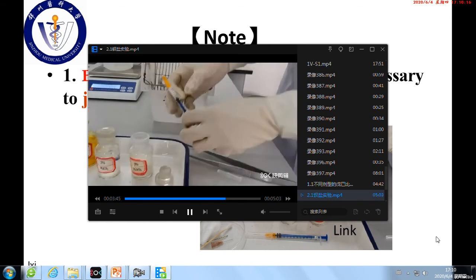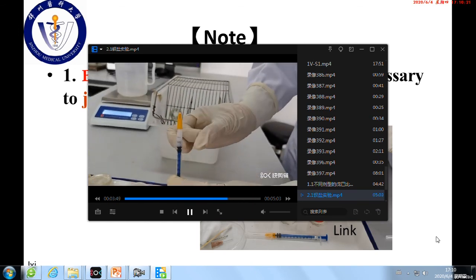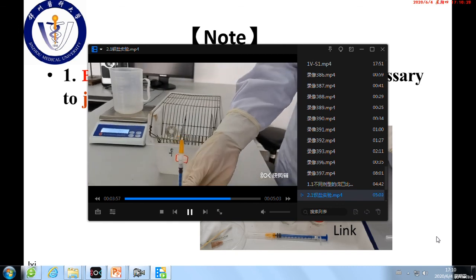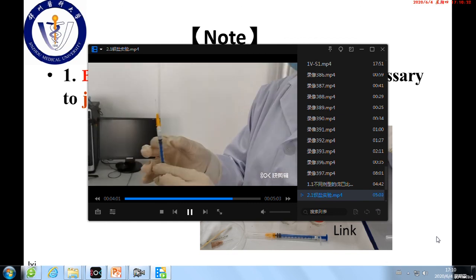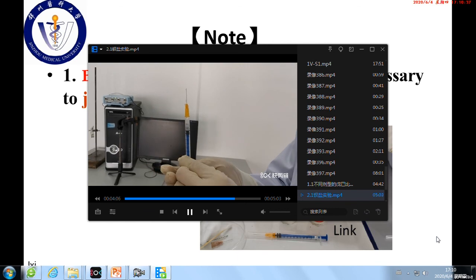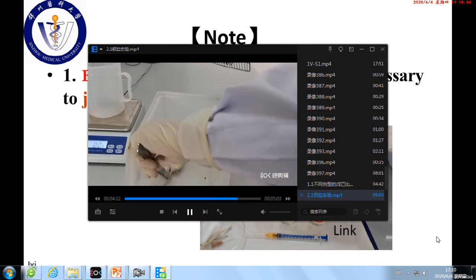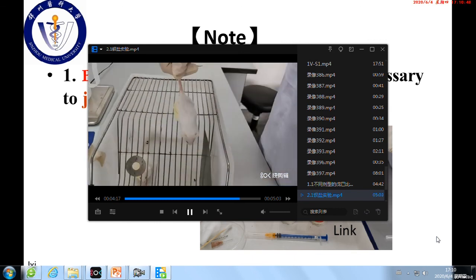To make sure the drug in your injector contains the barium sulfate, jolt the container of the drug. After ejecting the air bubble, adjust the exact required dose.